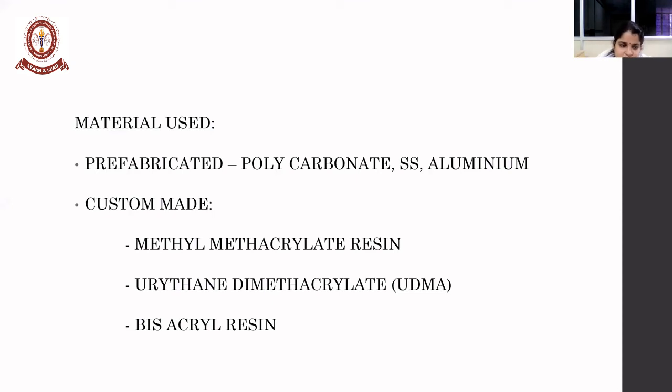The limitations of provisional restorations are that sometimes there might be a lack of adequate strength, and inadequate margin adaptation will be there. Poor aesthetics in long-term provisional restoration, plaque accumulation, and compromised bonding characteristics will be there, and mild to moderate tissue irritation also will be there in the provisional restoration.